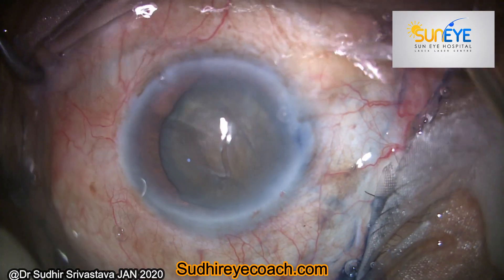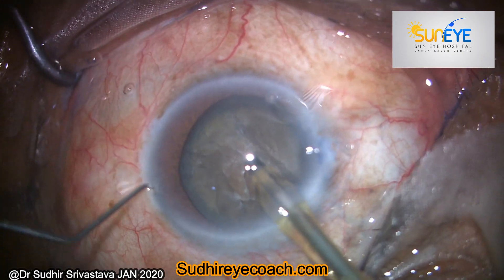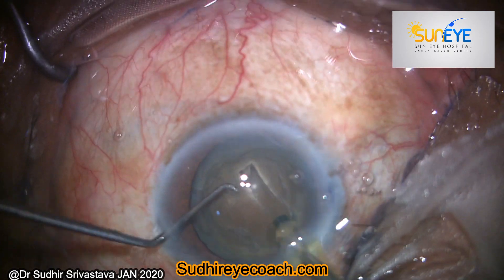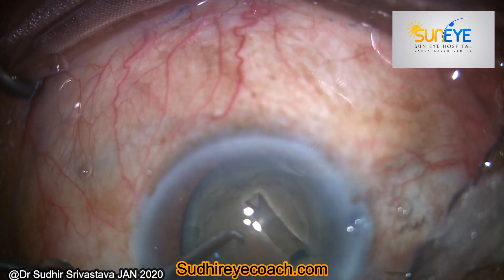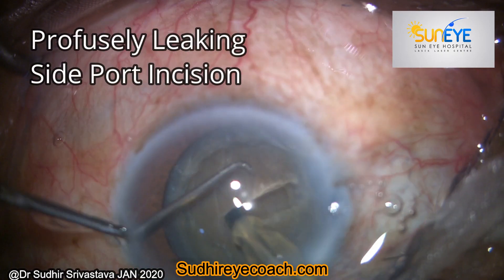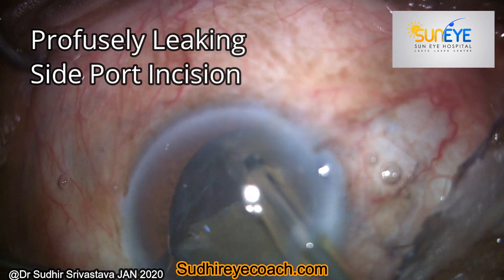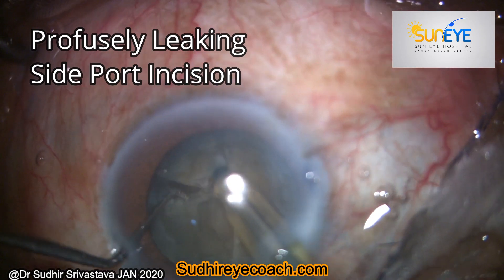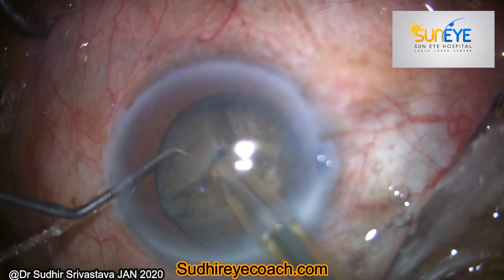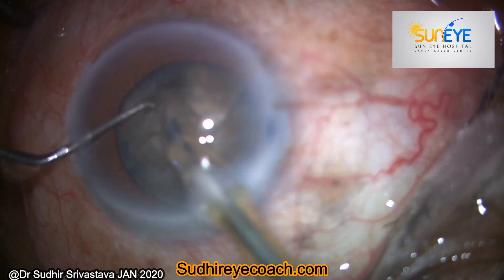Then I started my nucleus fragmentation. Because the nucleus was harder, I made a small trench and then rotated the nucleus and again completed the trench. Through vertical chop I divided my nucleus into two parts.